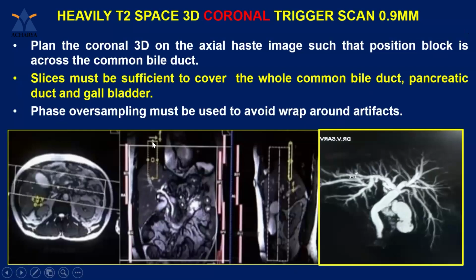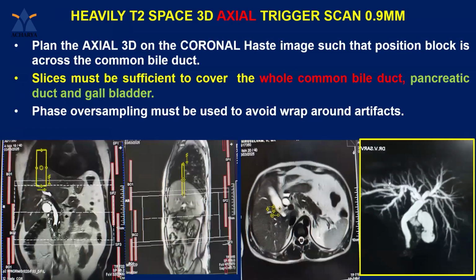This is actually triggered by the patient's breathing. It will take more than 4 minutes, depending on the slices. Then we will get the 3D images. These are axial 3D images.